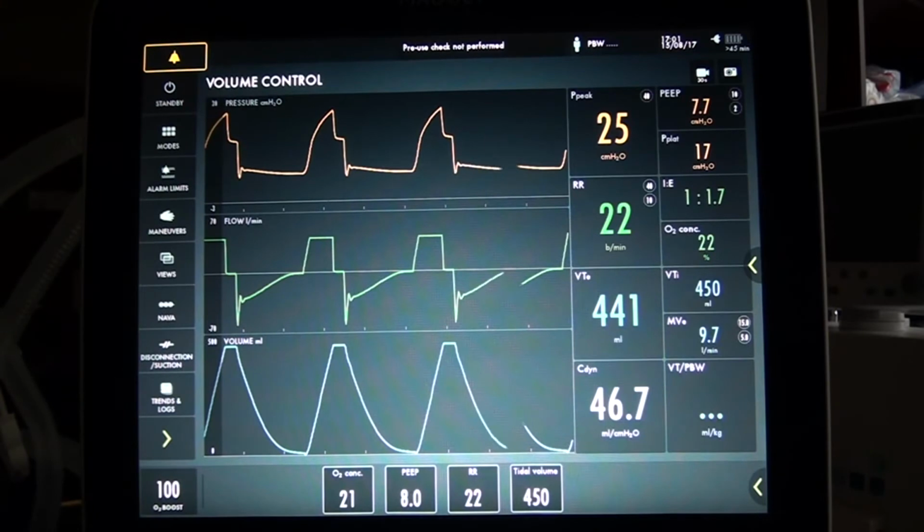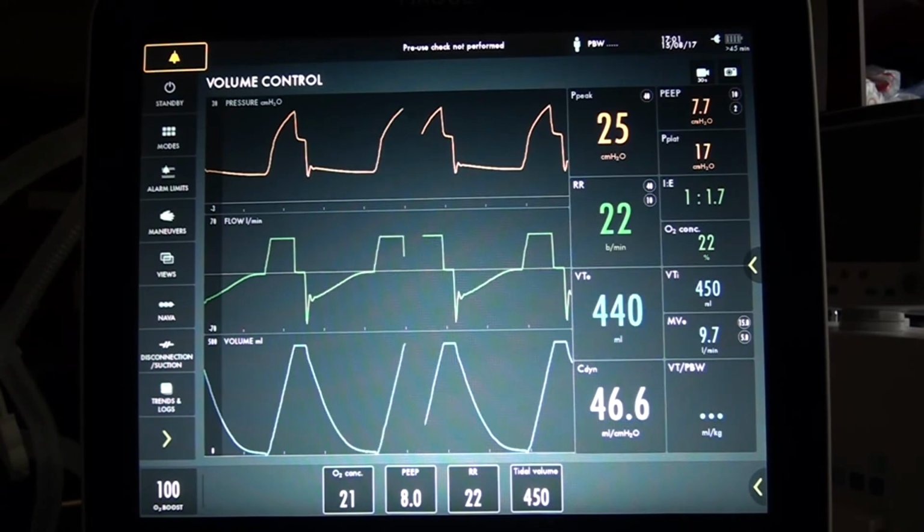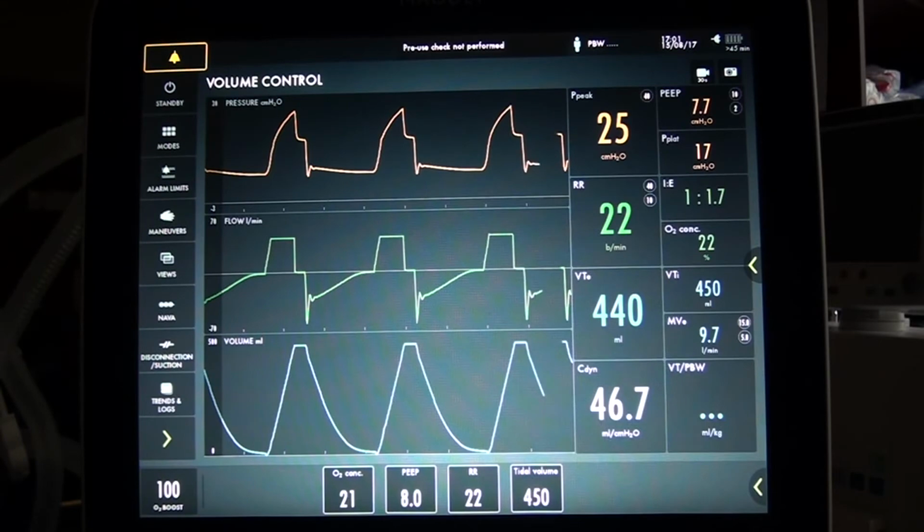If you look at the pressure, you see that at each insufflation the pressure goes up to a maximum we call the peak pressure. Then we stop insufflation for a very short time, and there is a drop in pressure down to a plateau. And we realize that this plateau is exactly the pressure in the alveoli. So it's the maximum alveolar pressure, the one which is at risk of injury for the lung. The difference between the peak pressure and the plateau is just related to the resistance of the airway, so we can make a diagnosis of obstructive lung disease, for instance. And the amplitude of the plateau is related to the compliance of the lung. So again, high plateau means low compliance, like in pulmonary edema or in acute respiratory distress syndrome.